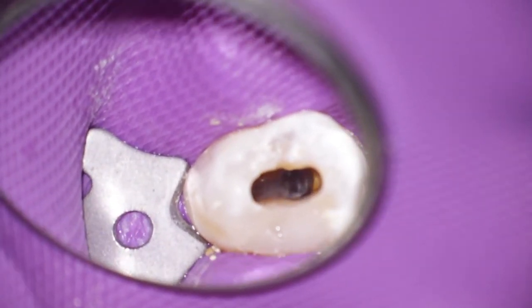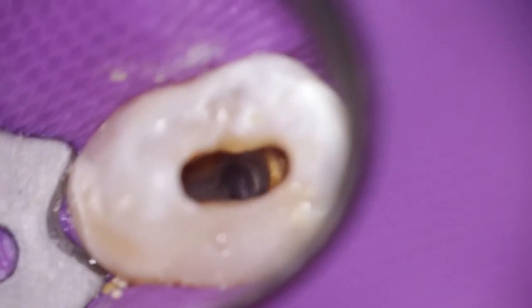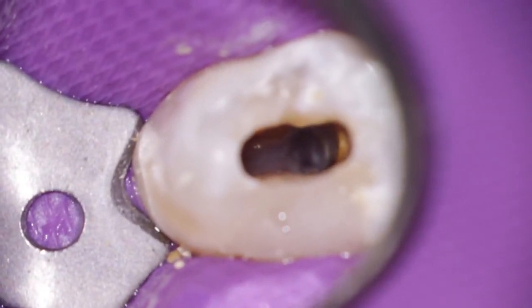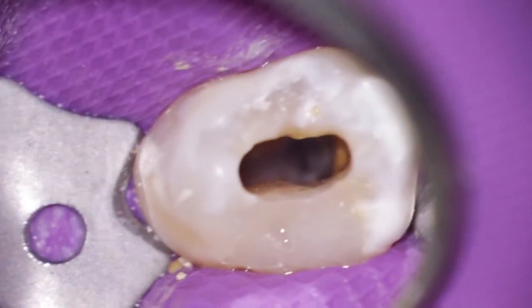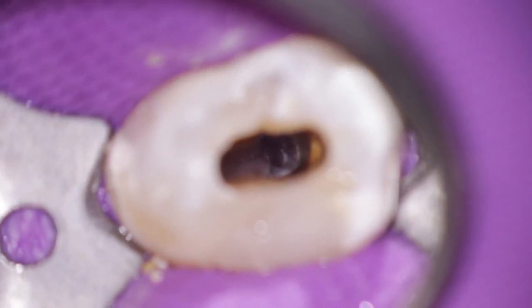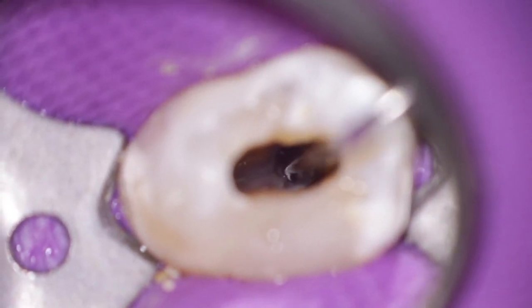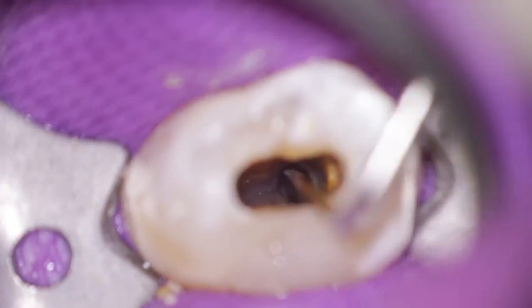Without the X-ray I wouldn't have had any clue that there was a third canal, right? Here it is. Third canal, distobuccal.